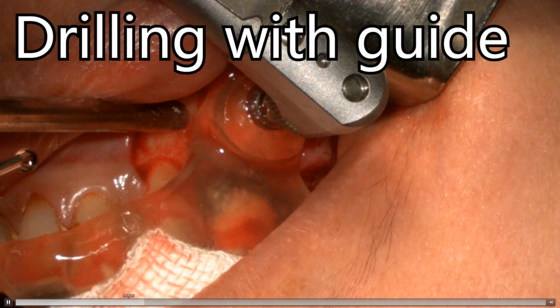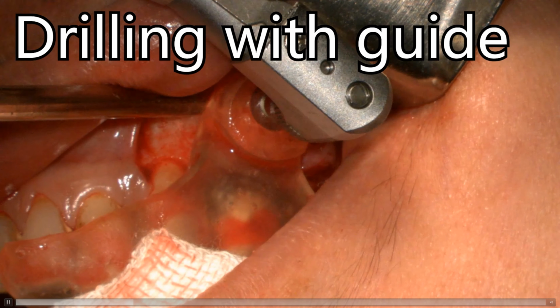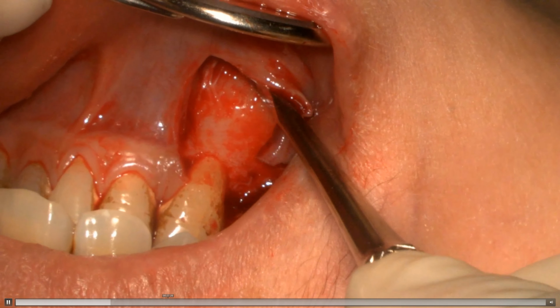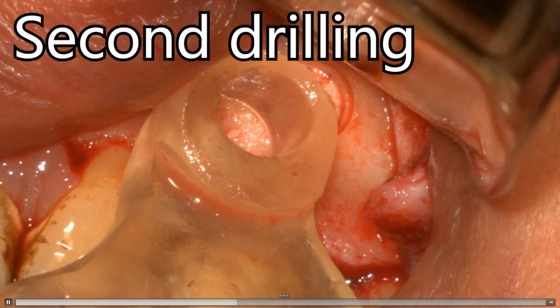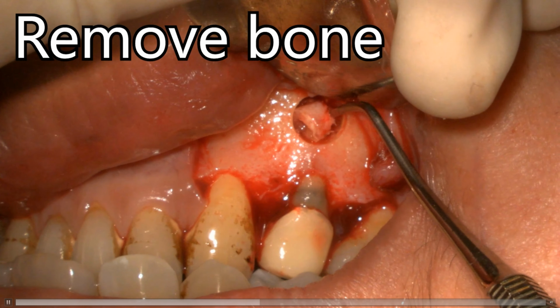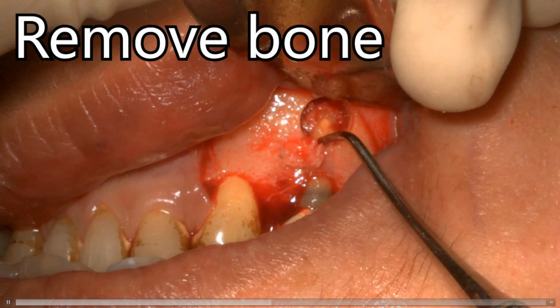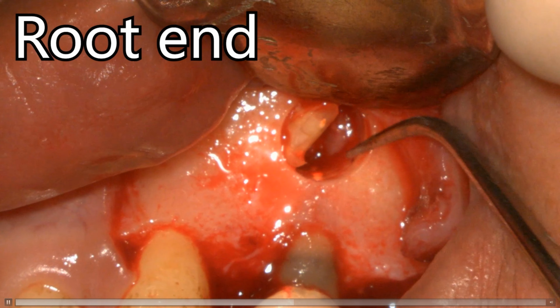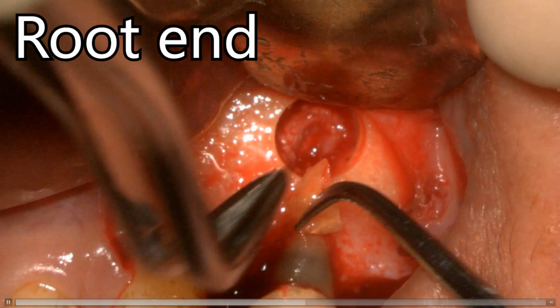And after the flap was reflected, you can see there is no penetration. You cannot find the root end here. So we use the 3D print guide to drill a hole. And I remove the apical bone and the root end together, which you can see is kind of a cylinder here.